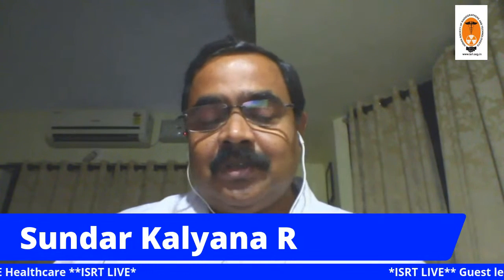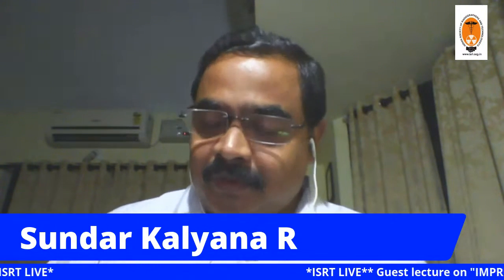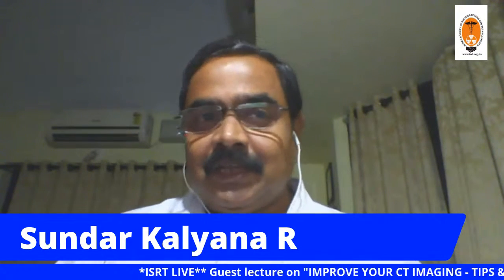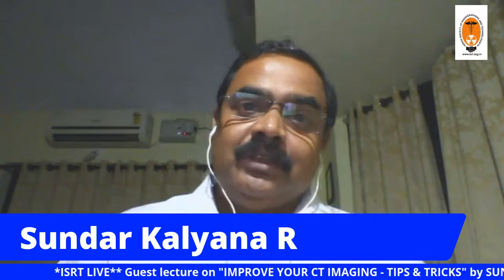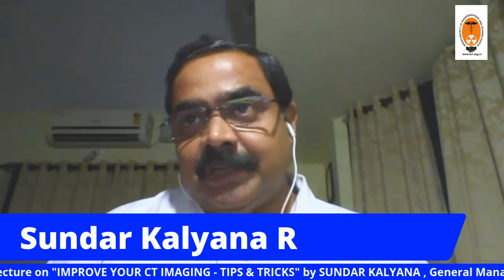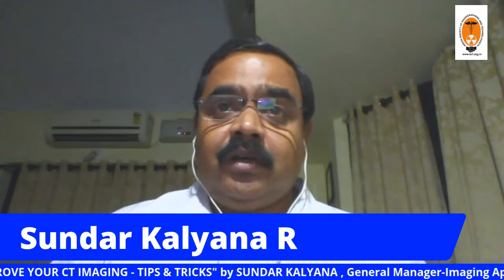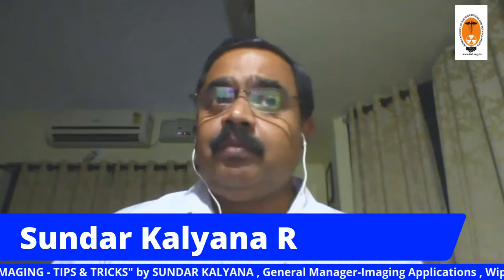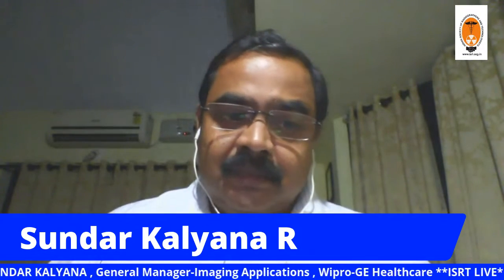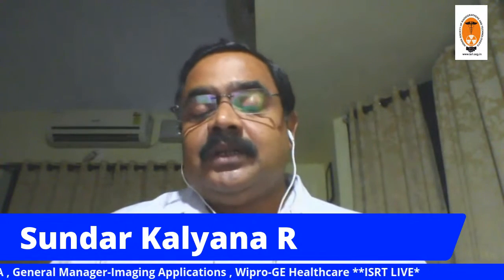So I would recommend, as a second important thing other than the scanning system, patient preparation. So please ensure you have sufficient sedation and supportive equipment as well as supporting staff to enable it. Right. I think that answers it.